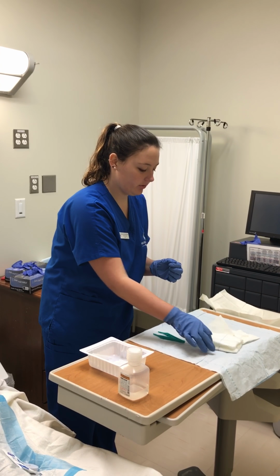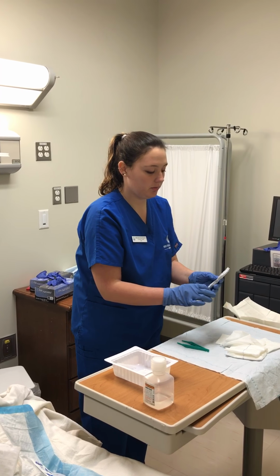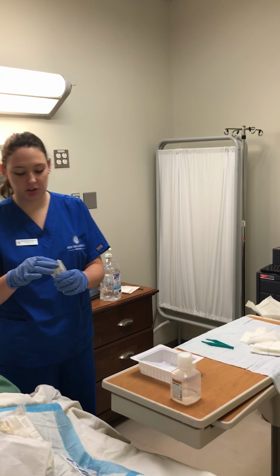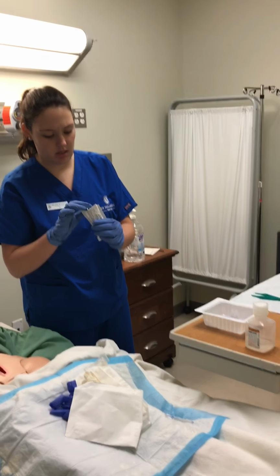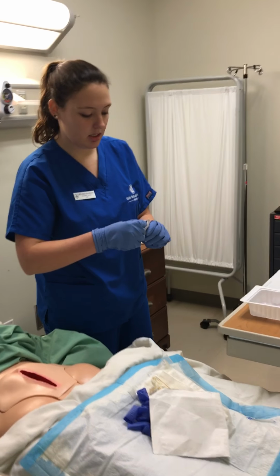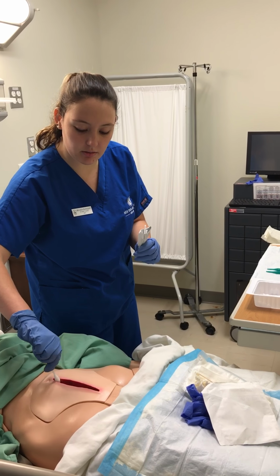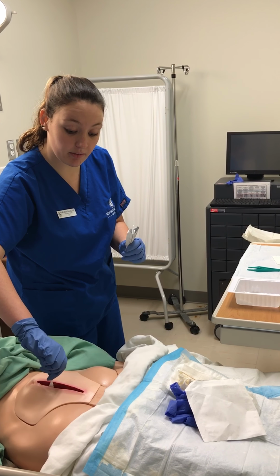Okay, I'm going to first start by cleaning. I'm going to do so by coming over to the wound. I'm going to start in the center. Make sure you have 3 swab sticks. And I'm going to go top to bottom, least contaminated to most contaminated.